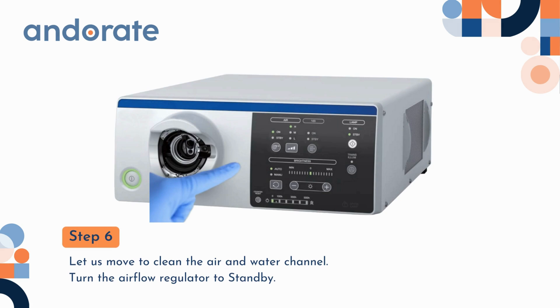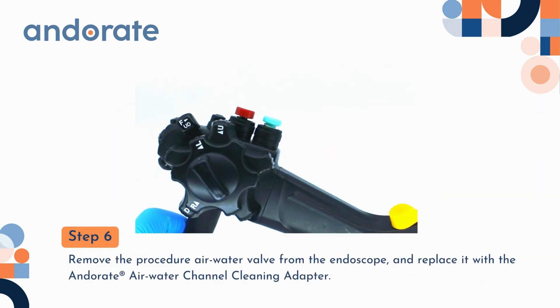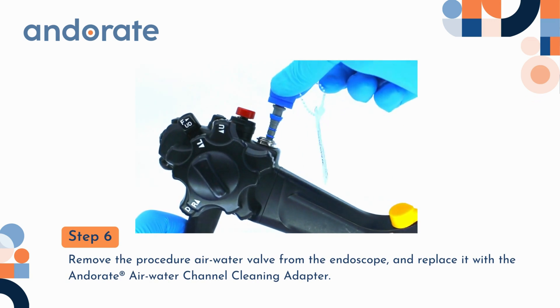Step 6. Let's move to clean the air and water channel. Turn the airflow regulator to standby. Remove the procedure air water valve from the endoscope and replace it with the Andorate air water channel cleaning adapter.